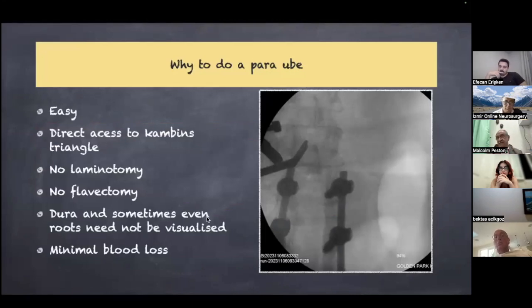This patient had undergone a fusion surgery in the past, adjacent disc disease, up-migrated herniation here. But what is the level? The level is L2. We are way up. Now, if I were to go for this fragment here, I would literally cut through the entire lamina and destabilize the spine.